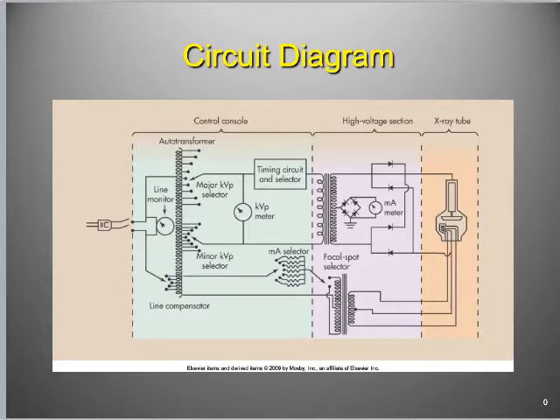The electrons are being boiled off. So the fancy word for this is thermionic emission. Thermionic emission is now occurring in the filament.